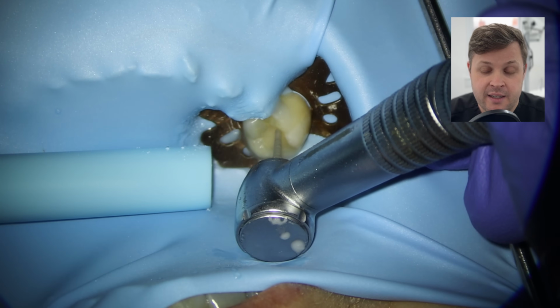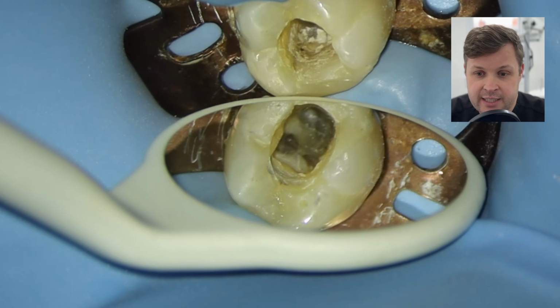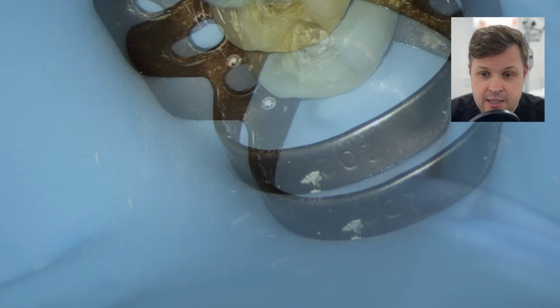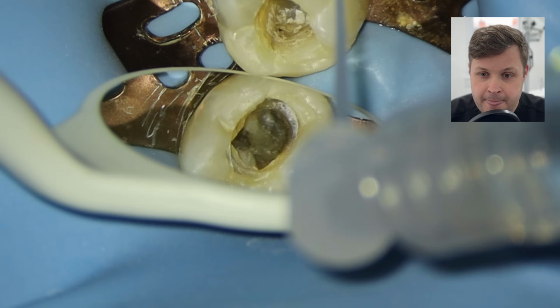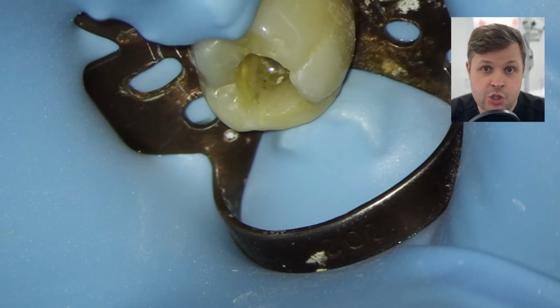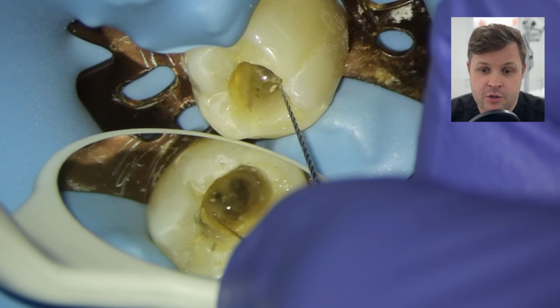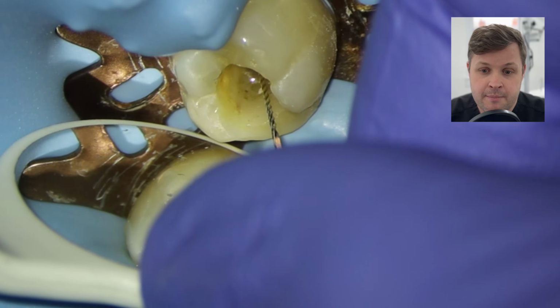As we move over to the tooth now, you can see I'm just about to remove that GIC temporary dressing, and giving it a bit of a clean out. When we look inside, we can see there are obvious canal spaces. In the first instance, I am going to fill the canal space up with sodium hypochlorite, and then take the working length of the mesiolingual.